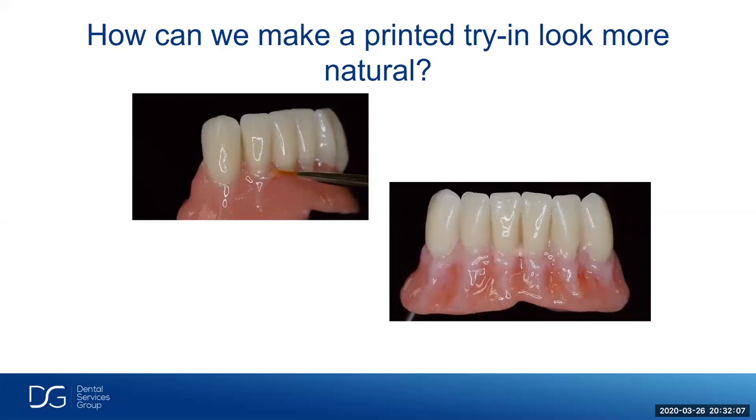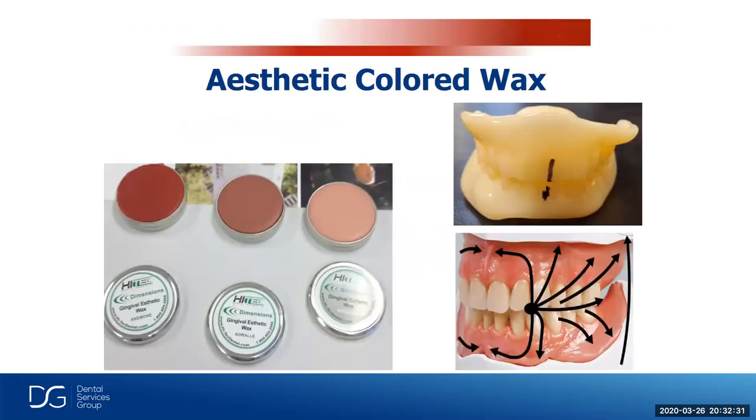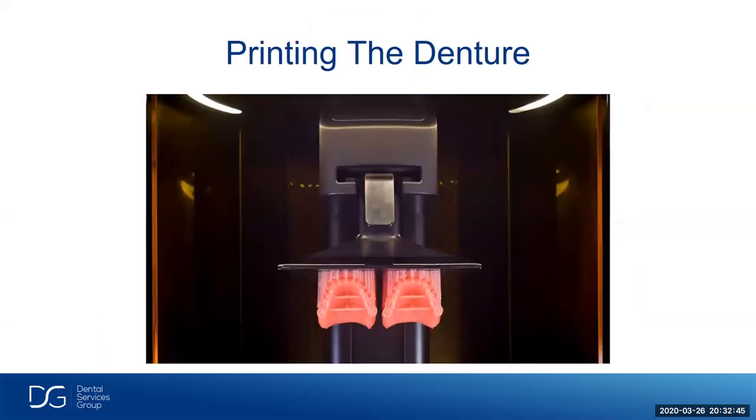We could take the time to put denture-based stain onto this monolithic printed try-in. It takes a lot of time. It may look nice. We could do this if you want. But what I recommend is using aesthetically colored wax, just like I did on the analog type wax-ups, so it looks a lot more natural for the patient when the patient sees it. It's something you have to get used to with these printed try-ins, but they really work out nicely. So we apply this aesthetically colored wax. I apply molten wax around the contoured printed try-in, and it really works out nicely. And it's a lot better than sending a monolithic type of printed try-in.